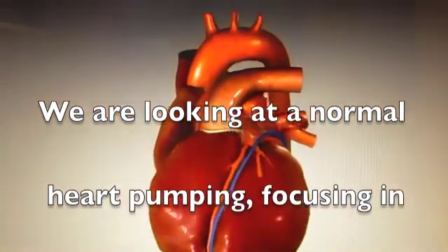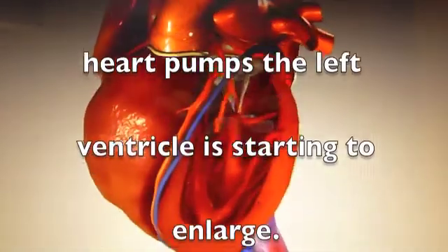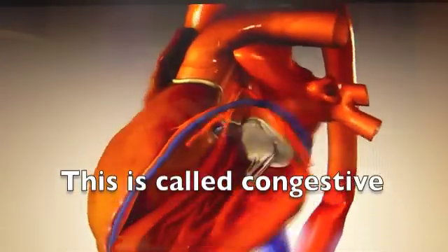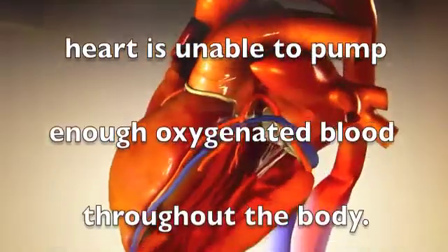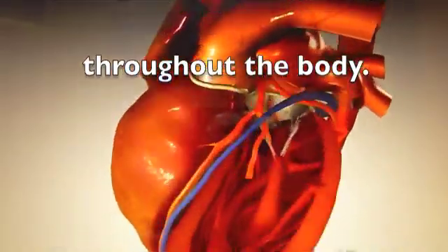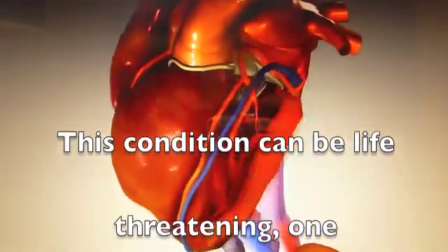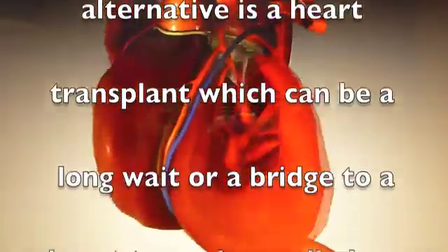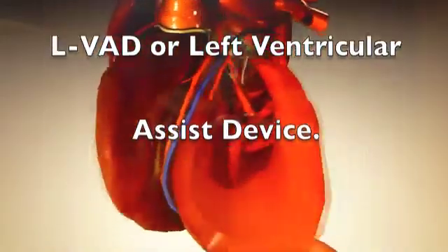We are looking at a normal heart pumping, focusing on the left side as the heart pumps. The left ventricle is starting to enlarge. This is called congestive heart failure. Over time, the heart is unable to pump enough oxygenated blood throughout the body. This condition can be life-threatening. One alternative is a heart transplant, which can be a long wait, or a bridge to a heart transplant, called an L-VAD, or a left ventricular assist device.